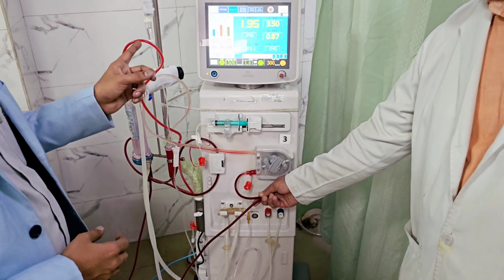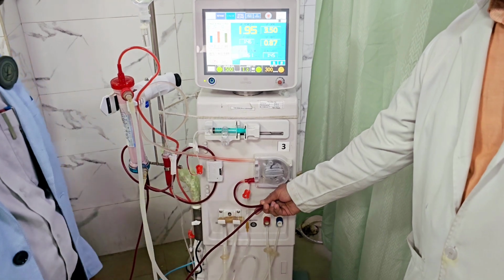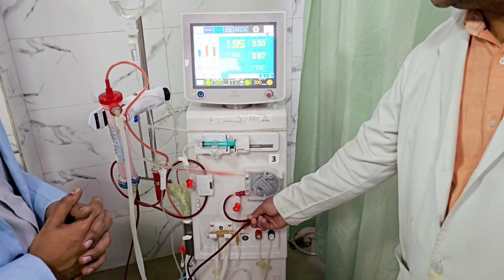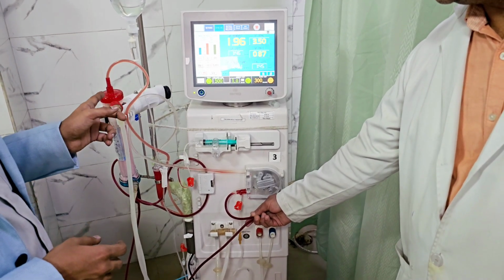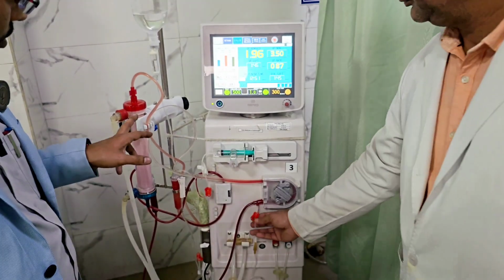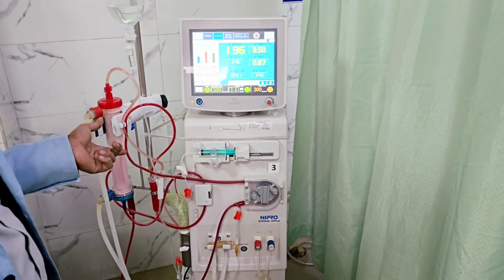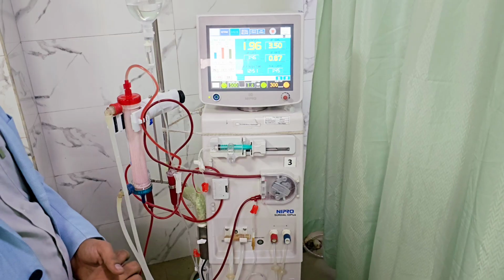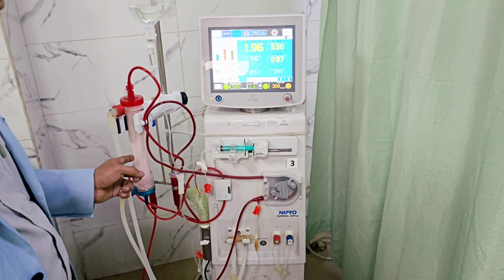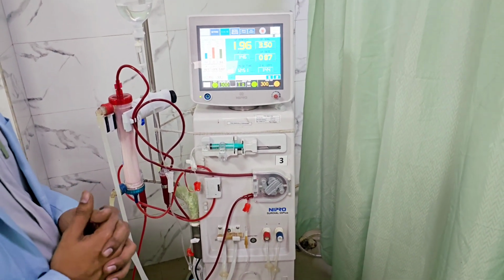Now the blood is totally diluted in the circuit, in the post-pump circuit. This is the pump. The blood before this is the pre-pump circuit. The circuit post pump is totally diluted, and this diluted blood comes to the dialyzer also. Now you can see here the blood is dark. Here it is somewhat diluted. The color difference you can easily notice here, by which the clotting risk will be reduced.